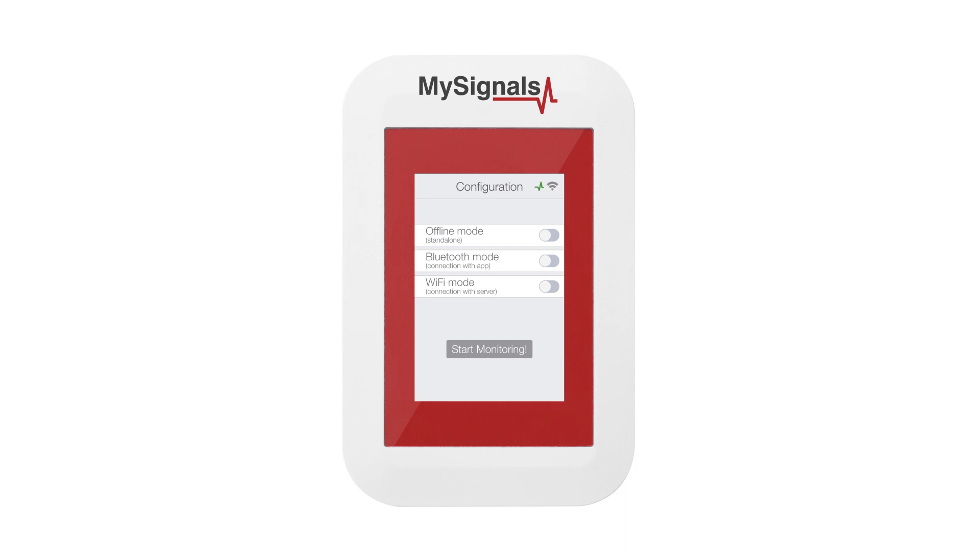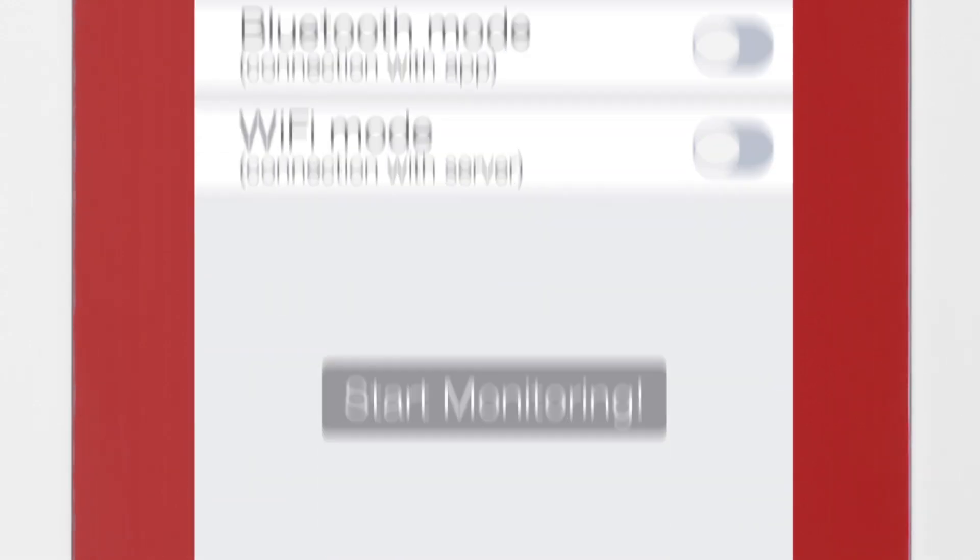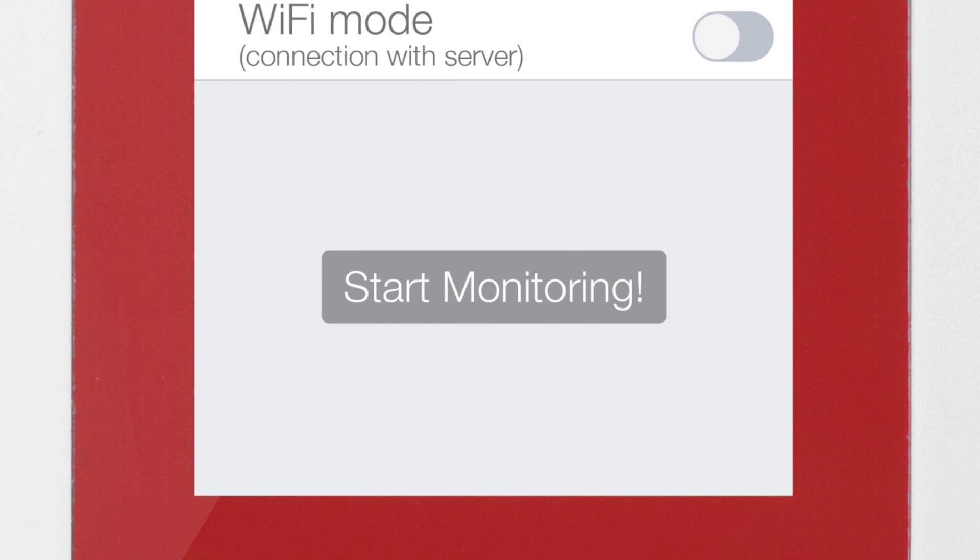First of all, power MySignals. It goes directly to the configuration menu. Select Offline Mode in the menu and click on the Start Monitoring button.